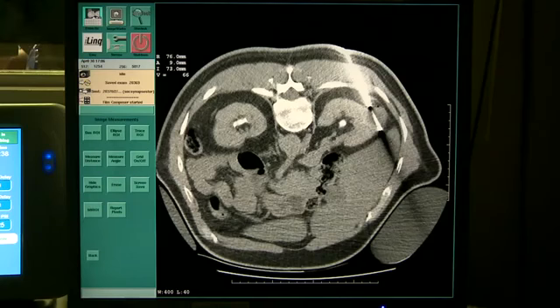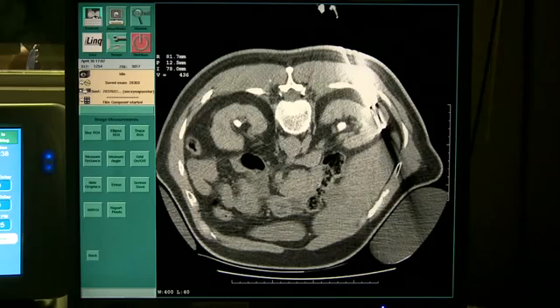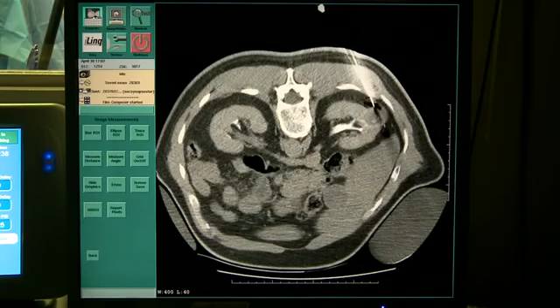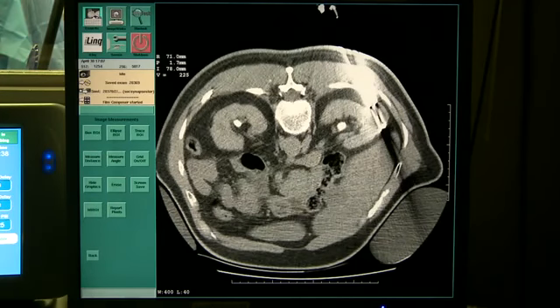These stay conspicuous for a really long time, which is just fortunate. As we come to the next cut, a couple of lesions, a couple of probes, and again these are offset, one above the other a little bit. The concern here is, what is the distance to this medial edge?